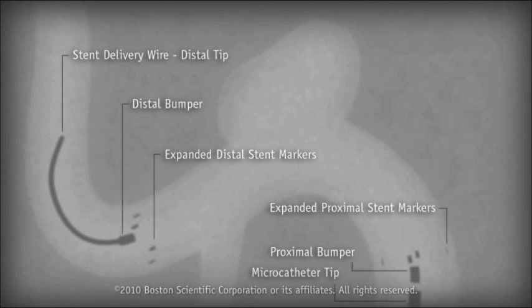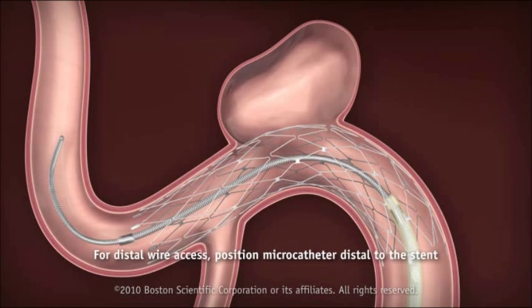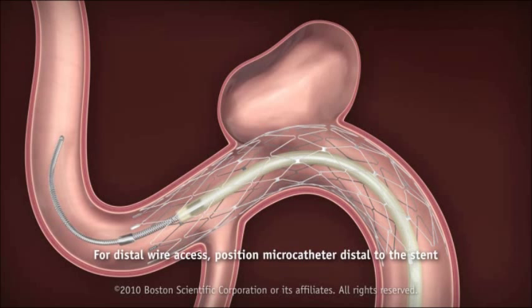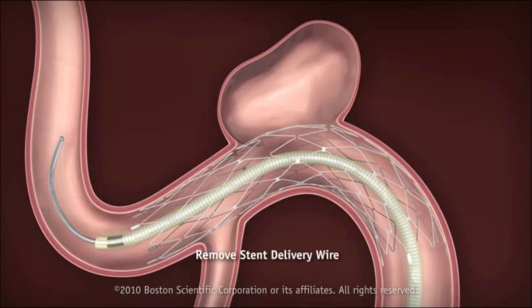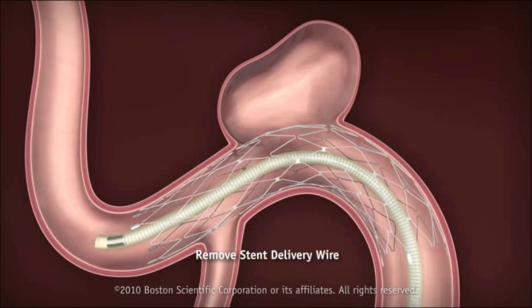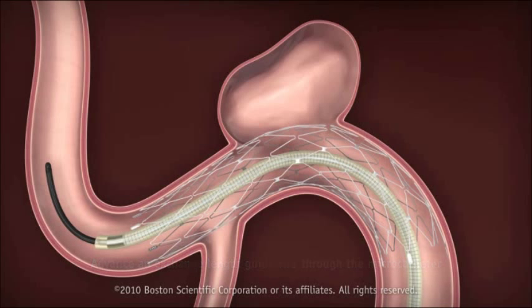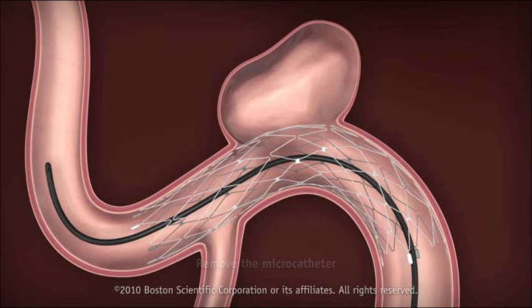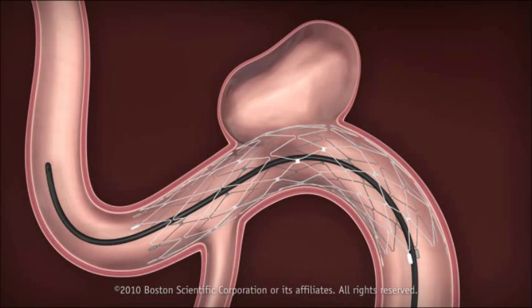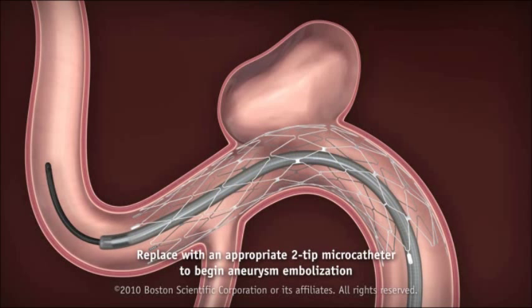Confirm deployed stent position under fluoroscopy. With the stent fully deployed for distal wire access, position the microcatheter distal to the stent. Once the microcatheter is in the desired position, remove the stent delivery wire. Advance an exchange length guide wire through the microcatheter. Remove the NeuroRenegade high flow microcatheter while maintaining the position of the exchange length guide wire. Replace with an appropriate two-tip microcatheter to begin aneurysm embolization.